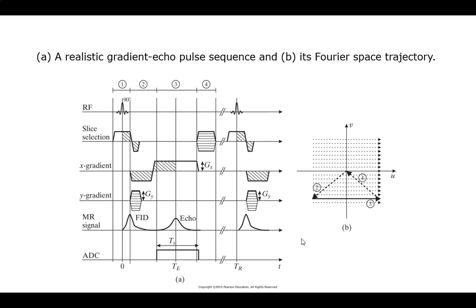Which, if you think about it, just consider powers of 2 and everything. So 30 is going close to 32, so you're at that point within a nice reasonable factor of it. It depends again on how much you want. You can go up to 64. How much resolution do you really need? If you're in the brain, it's probably higher. If you're in the chest, it's going to be lower. So this all depends on the doctor's needs.